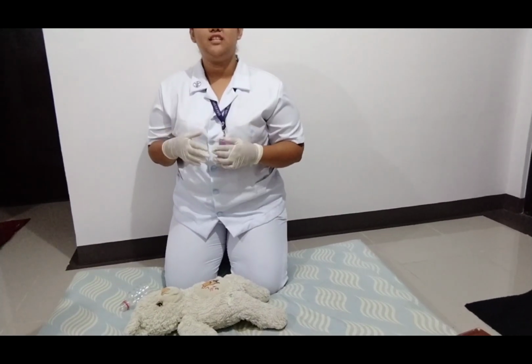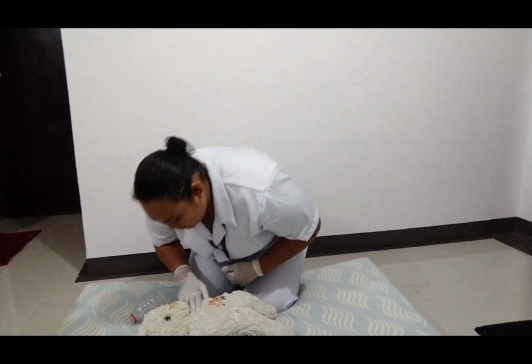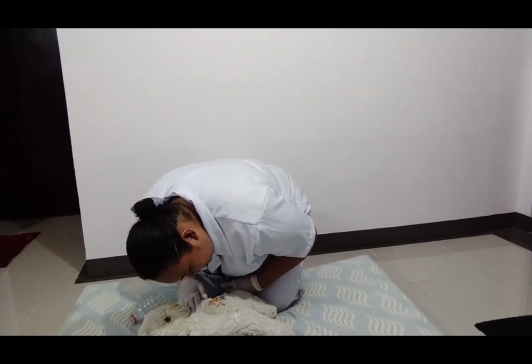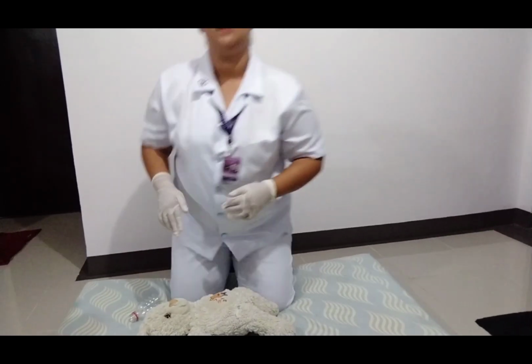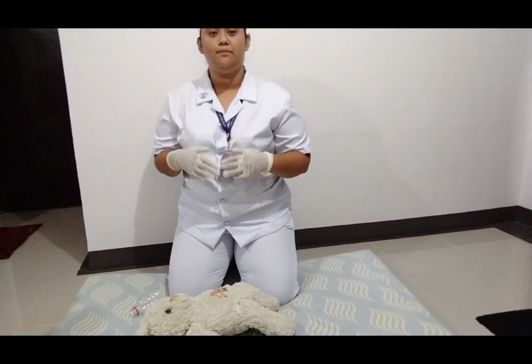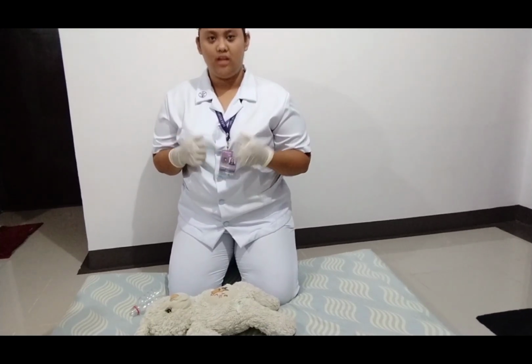So after doing that, check again the patient's breathing and pulse. Okay, I see that the patient is not breathing and has no pulse. I am now going to proceed with the doing of cardiopulmonary resuscitation.